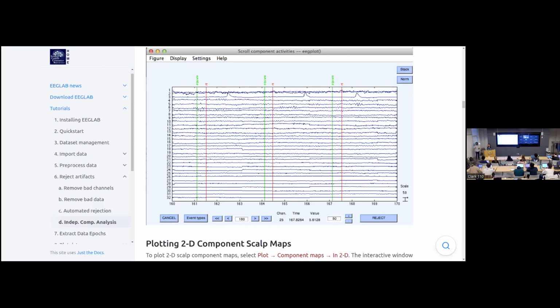Whereas in PCA, imagine you have a high dimensional plane, or let's make it simple, a two-dimensional plane. You plot a bunch of data across this plane, and then you want to make some kind of regression over this. You want to find the trends about the distribution of all of this plotted data. What principal component analysis is going to do is find the axes in this manifold along which your data gives you the variance.